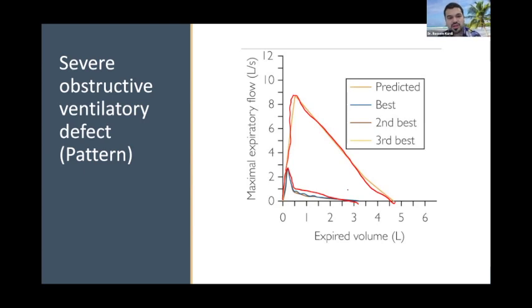As Dr. Noor mentioned, we usually say that this is a ventilatory defect or a pattern. If you want to be exact in your terminology, you don't say, as people always say, obstructive airway disease. Well, we do not know if the disease process is in the airways, or if there's a disease process at all. This could be a normal variation or a lot of different things. PFTs are not diagnostic per se. Think about them as one of the tests or radiological tests that you would be sending for a patient. You have to put them in context with the clinical picture. So usually we'll say this is an obstructive ventilatory defect or an obstructive ventilatory pattern, rather than saying this is obstructive lung disease or obstructive airway disease.